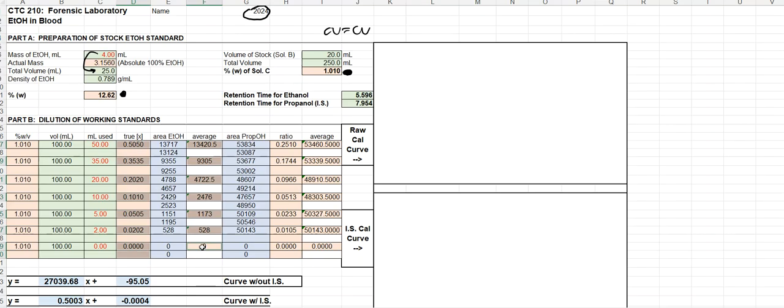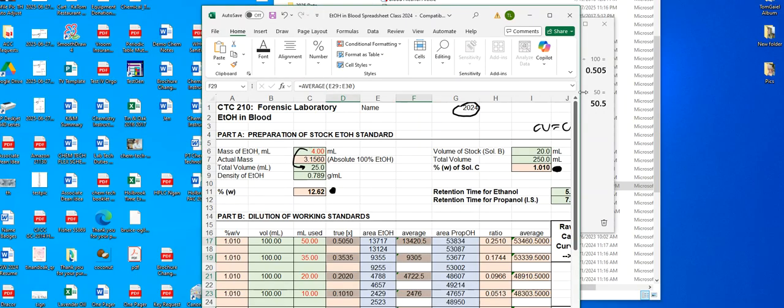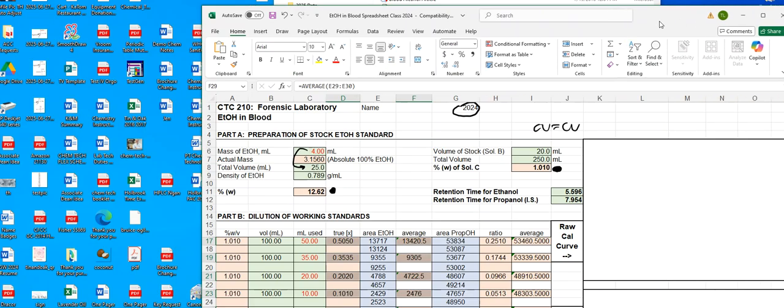All right. By holding the control down, you can select more than one thing, right? They don't have to be adjacent cells. You can click and pick and do whatever you want to do. Once those get highlighted, at the very top of this Excel spreadsheet, and I'm going to drag this out just a little bit so you can see it.